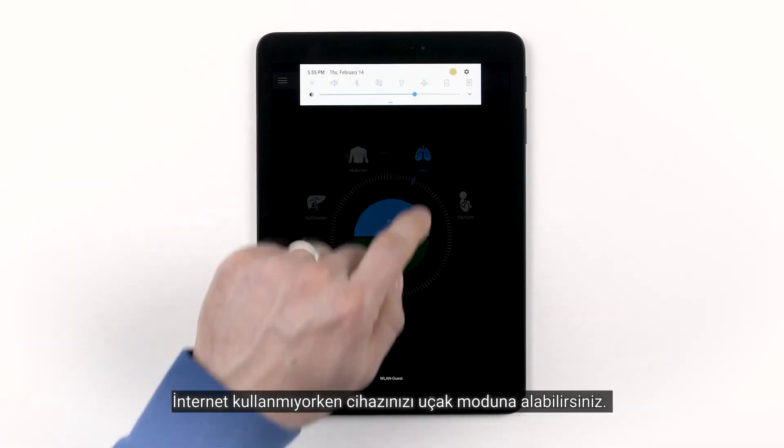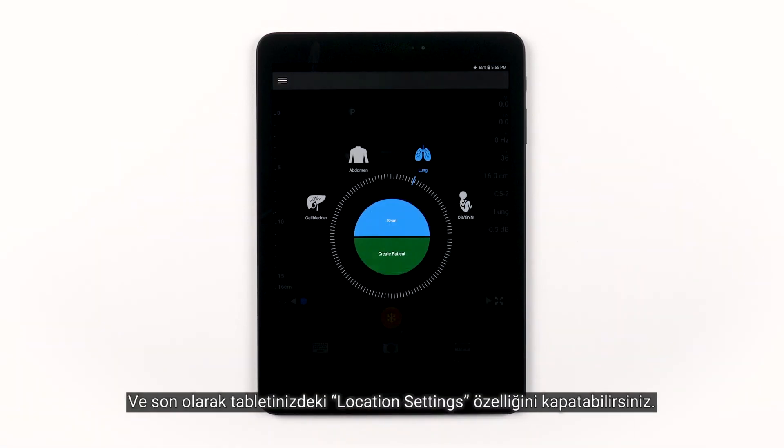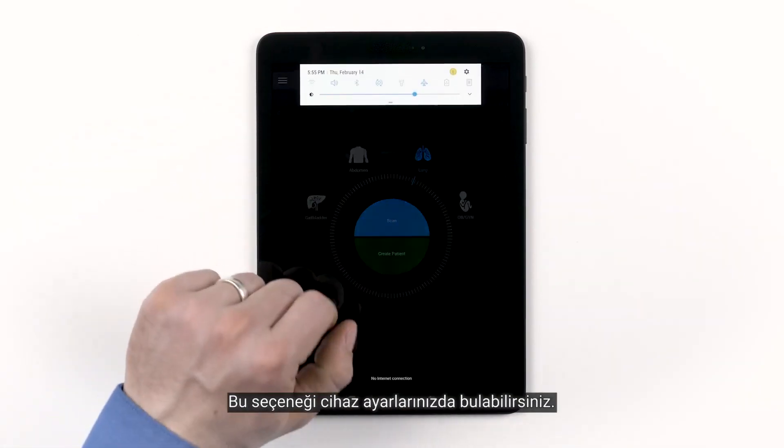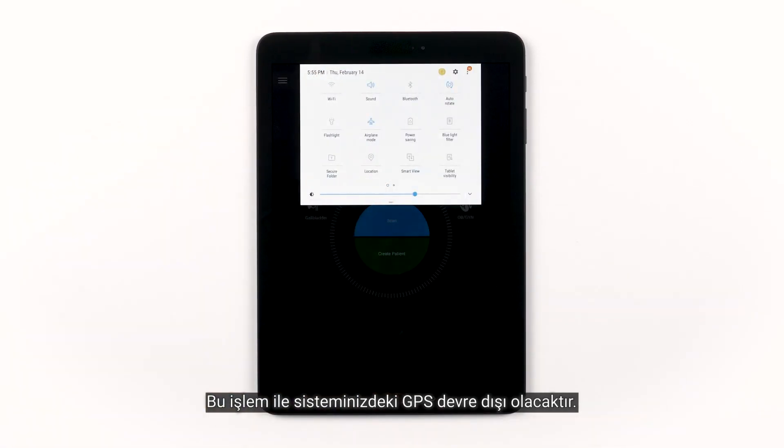You can put your device into airplane mode when you're not using the internet. And finally, you can turn off your location settings on your tablet. You will find this option in your device settings. This will deactivate the GPS within your system.